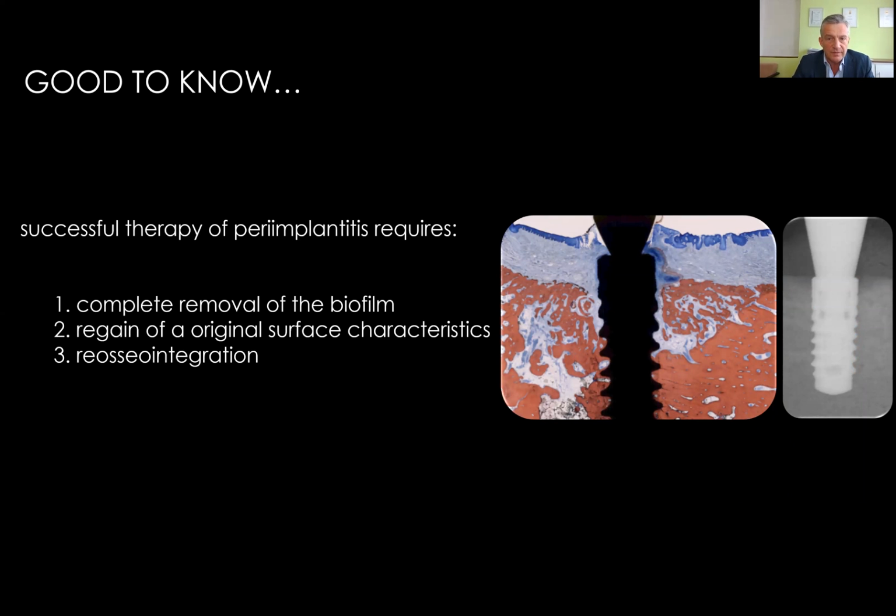These were the requirements. And normally we assess that by X-ray. You see the same case on the X-ray and in histology. This is a sample of a dog study we did. This implant was treated in a conventional manner. And on the X-ray, we were very happy because we saw bony regeneration proven by X-ray. But in histology, we see what happens in reality. New bone, which is not attached to the implant surface, because we did not succeed in achieving a surface which allowed an integration of regenerated bone.